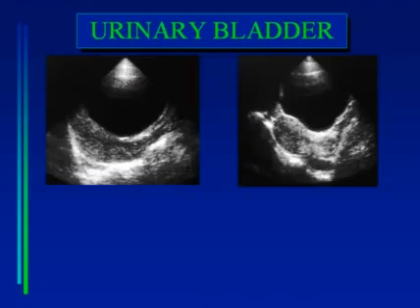In a similar example, we have a structure that was initially thought to be the bladder here, no posterior impression of the uterus on the bladder, and at a different time in the study, though, the patient's bladder actually filled. And now you can see the bladder here. You can see the expected posterior indentation of the uterus on the bladder. And where did the mass go? The mass went up here. The bladder pushed it out of the pelvis, and you can just see the leading edge of this mass on the transabdominal image with the bladder full.